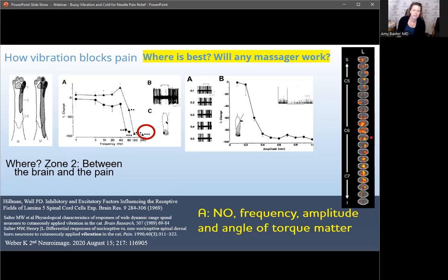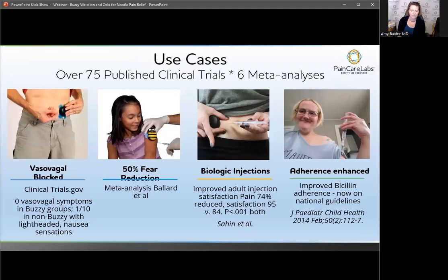And the vibration, as we mentioned, is also shown all over the spinal cord. So as opposed to an electrical stimulus, which we often get asked, the natural touch stimulus or the stimulus that comes from a brushing or a vibration, those are the ones that are going to be scattering neurotransmitter all up and down about 4 vertebral lengths.